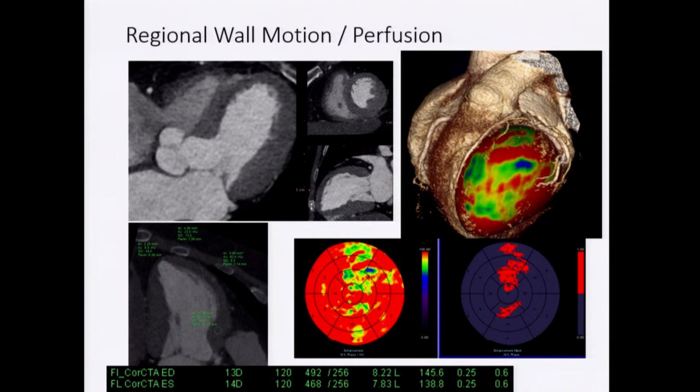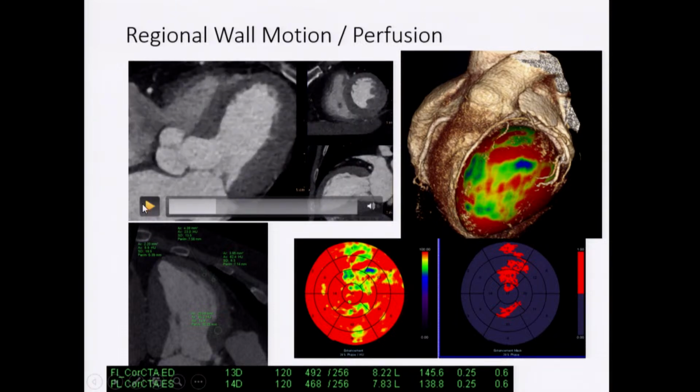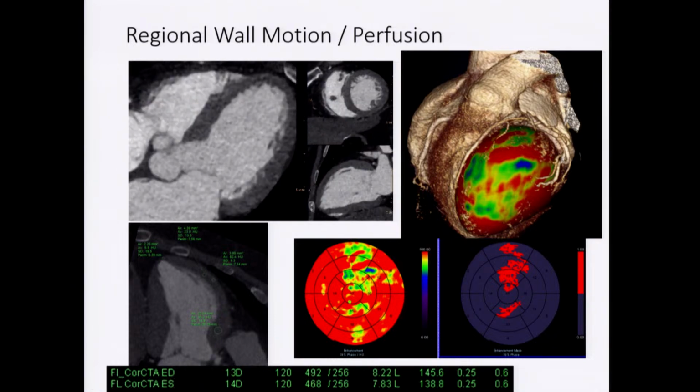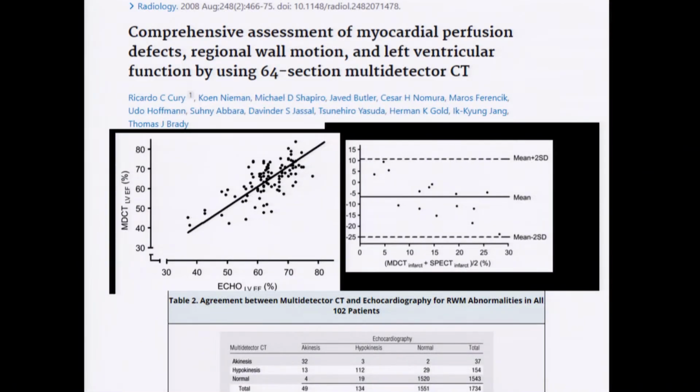If you have any lesion and you have wall motion abnormality, so basically this is a patient we did two phases, flash mode. Okay, let me see if I can play it one more time. You can clearly see the apex and apical anterior wall, apical septal, don't work very well, and there are some perfusion differences, so that lesion you see is clearly very significant.